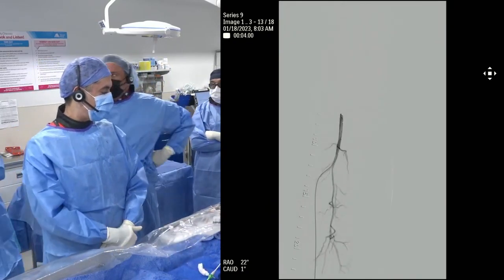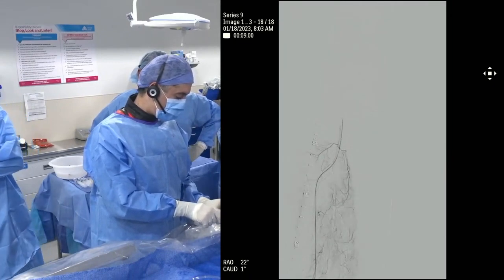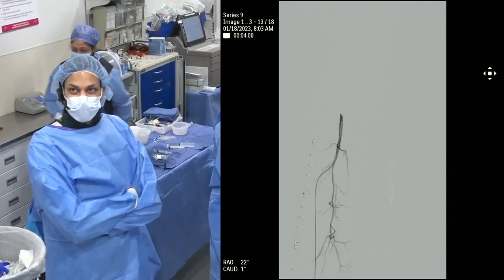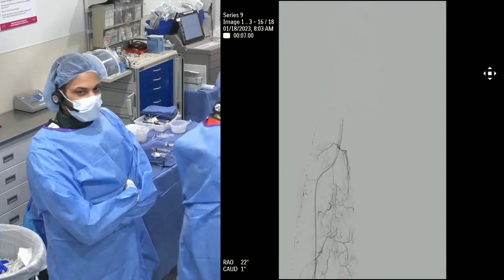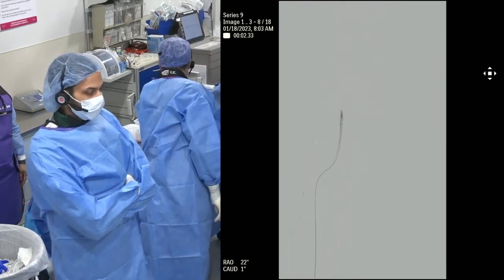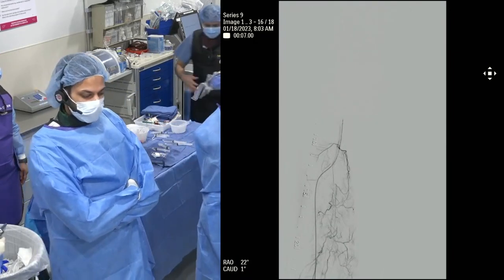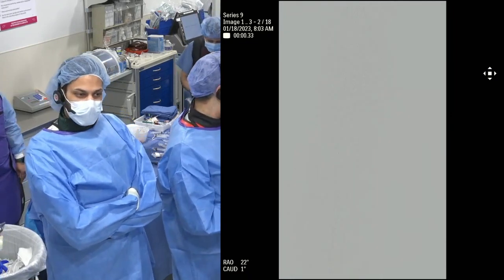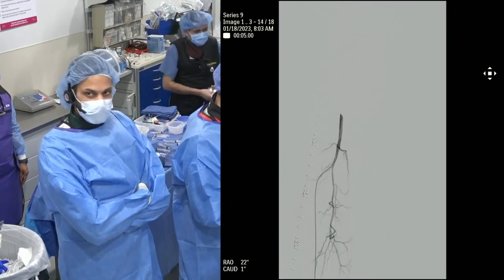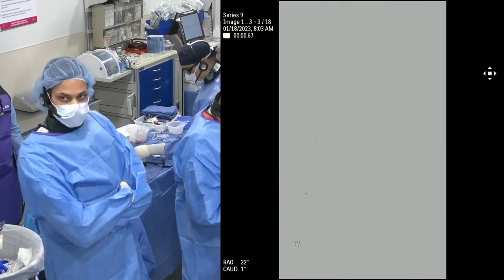Well, those are all the points. Number one, it's just very technically challenging. You have better luck than I do, but every time I've tried, my catheter just buckles out because of that acute angulation. I think steerable sheaths have definitely helped us a lot with cannulating viscerals and going up and over for these acute angulations, but it's still not ideal. And if you push, you could put too much force on the graft and disrupt your proximal anastomosis, which would be a huge aortic disruption and potentially life-threatening. So I don't think it's a great option if you have other choices.